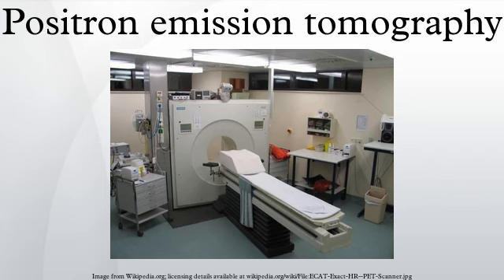Alternative methods of scanning include X-ray computed tomography, magnetic resonance imaging and functional magnetic resonance imaging, ultrasound and single-photon emission computed tomography. While some imaging scans such as CT and MRI isolate organic anatomic changes in the body, PET and SPECT are capable of detecting areas of molecular biology detail.